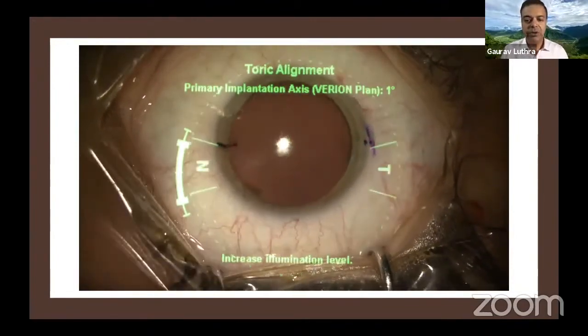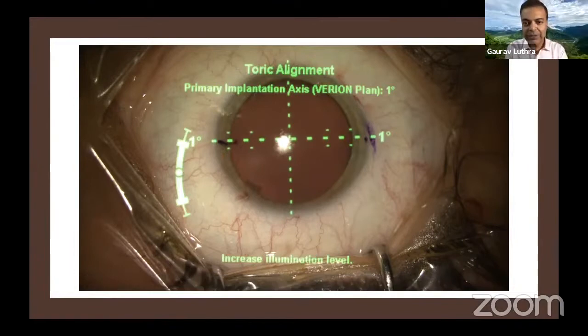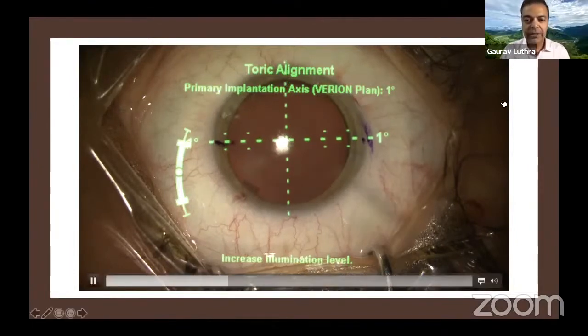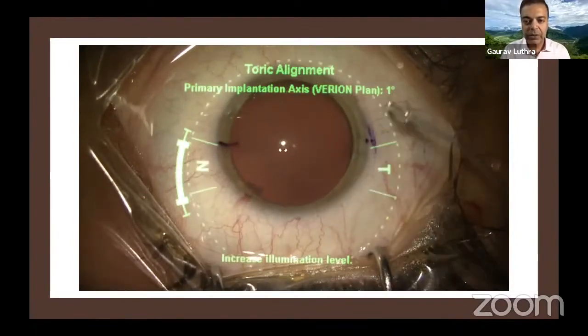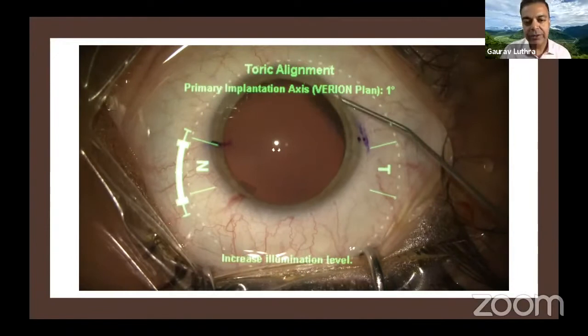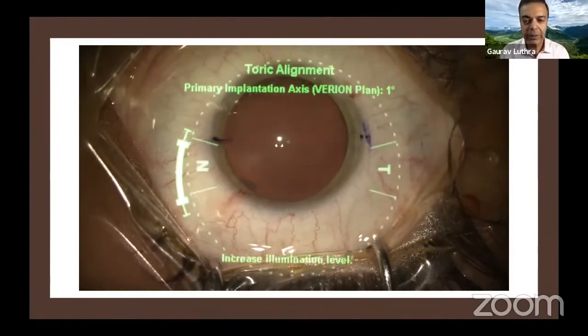And for the main port, for ICLs, we actually use a 2.8, 3 mm incision, which probably Mani was not making. For some reason, we were using something else. A disposable Indian blade was being used. And just watch what happens when we make the main incision, because you need a slightly larger incision for the main port for ICL, whereas for cataract I use a 2.2 Mani double bevel blade.